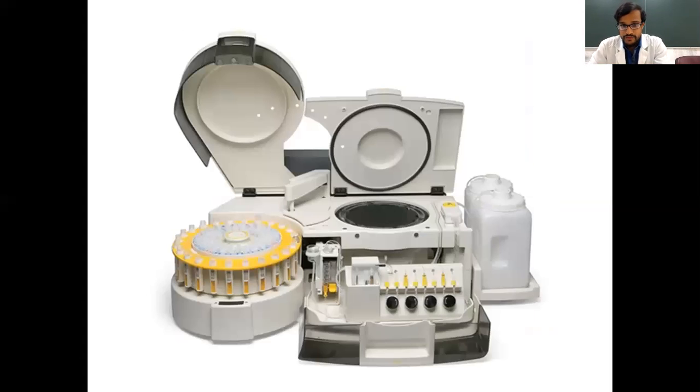So this is the fully auto analyzer when it is opened. Here you can see different parts where there is place for the samples. You can see there is space for the samples and there is place for the reagents. The reagents are already placed, and there is place for the cuvettes. We will add the reagent and sample in the test tubes. In the same way, there should be cuvettes in the auto analyzer, in which the auto analyzer itself adds the sample and the reagents into that cuvette. They are known as reaction cuvettes.